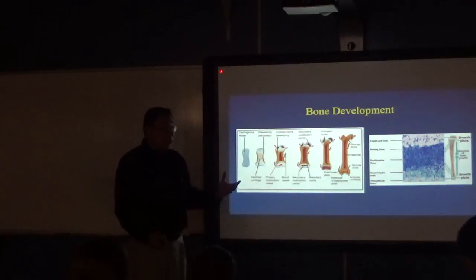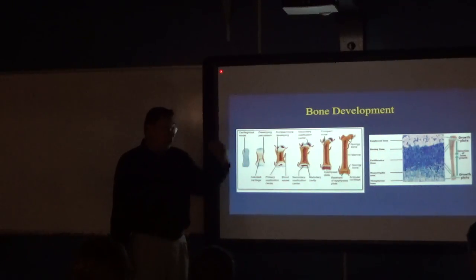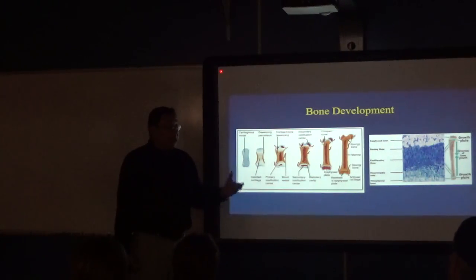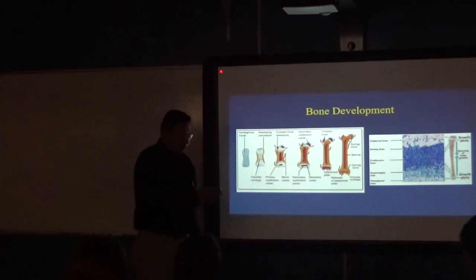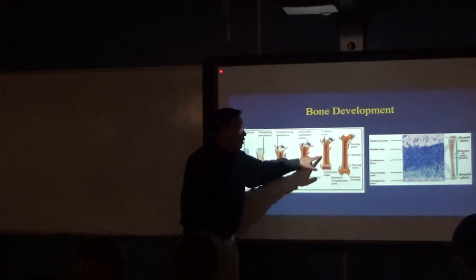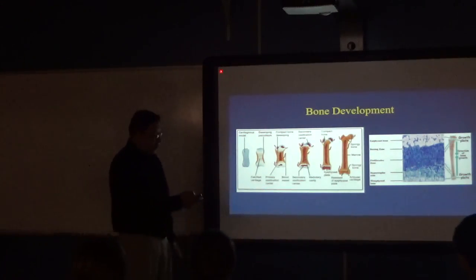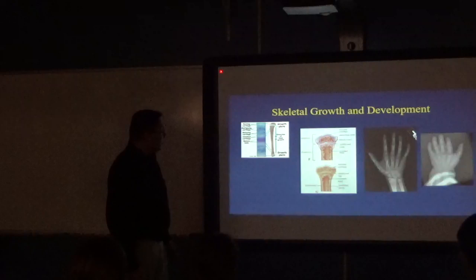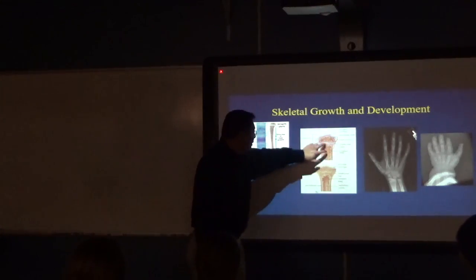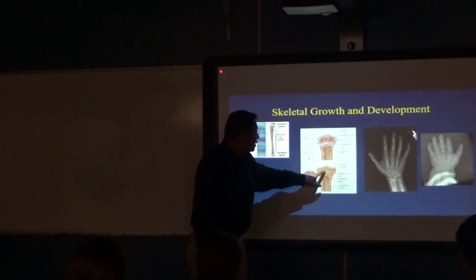Unfortunately, when you get an x-ray, the growth plate is a dark line. And when you press on the growth plate, if it hurts clinically, always suspect there is a growth plate injury until proven otherwise. Because a fracture, you'll see later, a fracture through the cortex here, you see a line. But the growth plate is a line. When there's a fracture through it, you can't see any. Again, epiphysis, metaphysis here, in the shaft, and in an adult, it closes up.